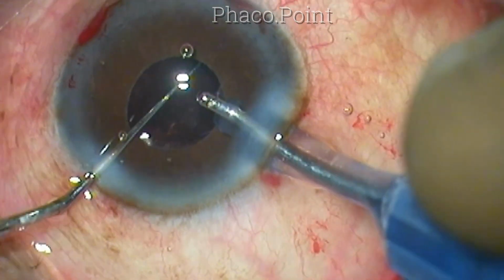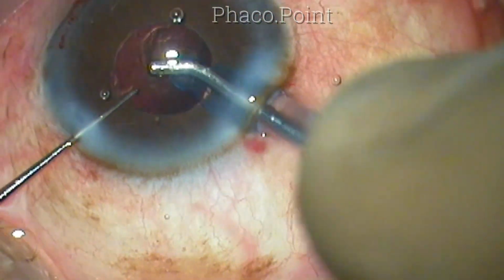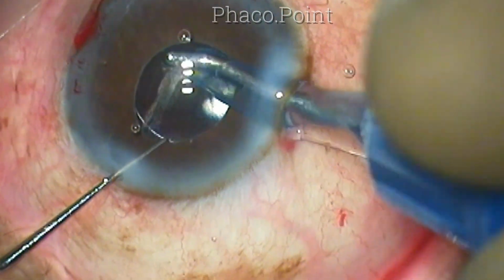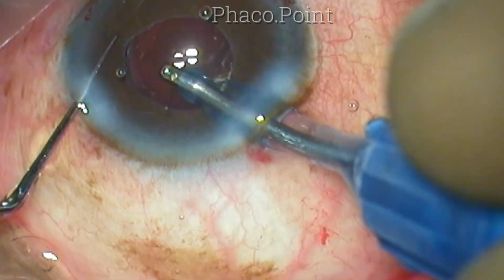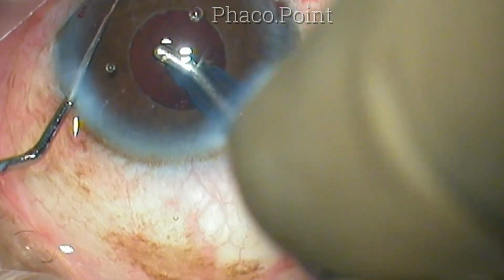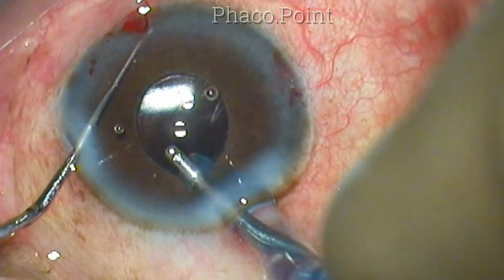So viscoelastic is carefully washed out from within the capsular bag. The IOL is then pivot rotated to the horizontal position, and the act of pivot rotation sometimes, or rather many times, will free the cortex. I found that after performing pivot rotation I was able to isolate and remove some more of the cortical material, so that the bag is now completely free of all cortex. The sweep of the haptics during pivot rotation can dislodge fragments, it can free the cortex. It will also help you to align the intraocular lens in the correct position.